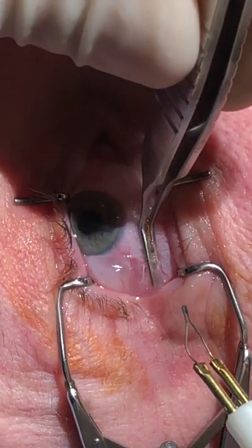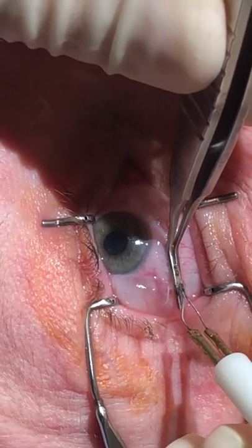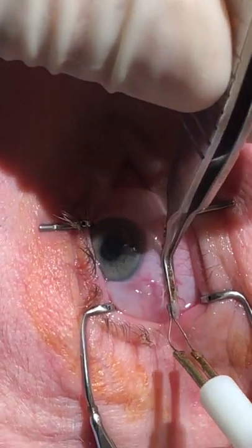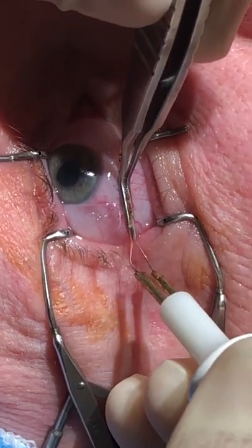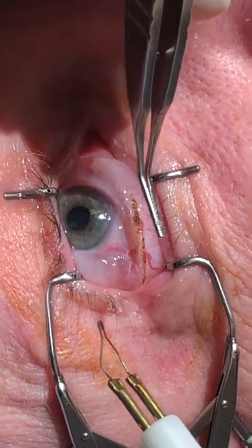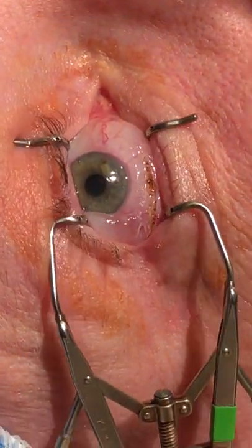You can see it's a very easy procedure in terms of patient tolerance and surgically a very simple procedure. Like I said, I've tried suturing, I've tried everything else. You can see that conjunctiva that was big and floppy has now come and tightened in.